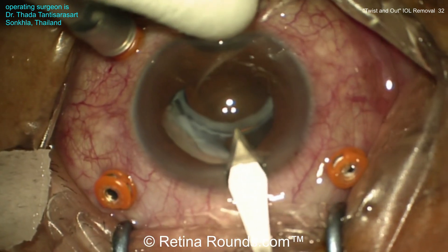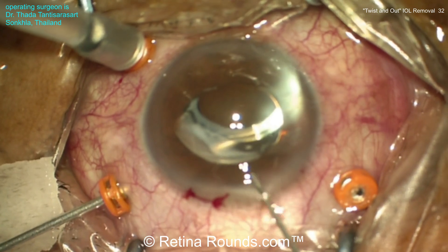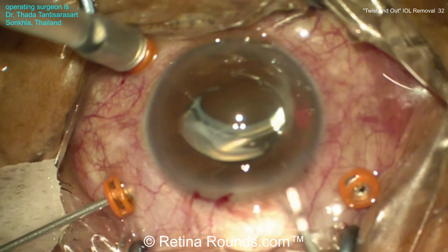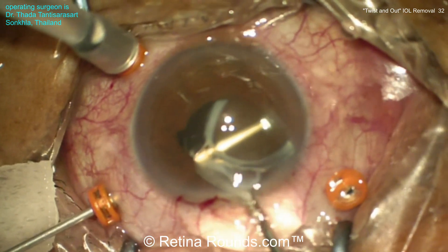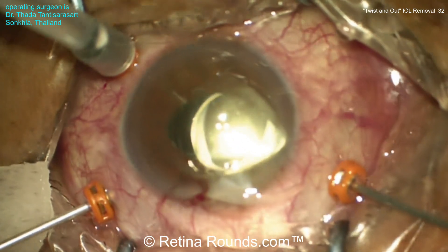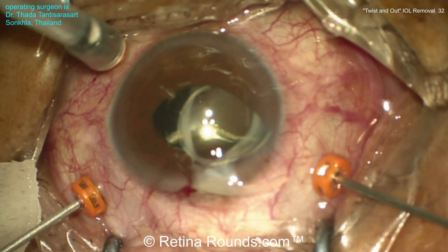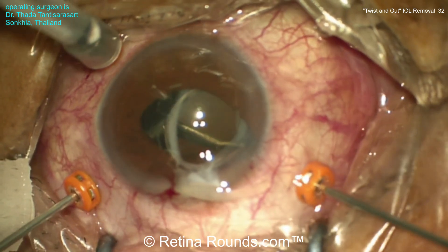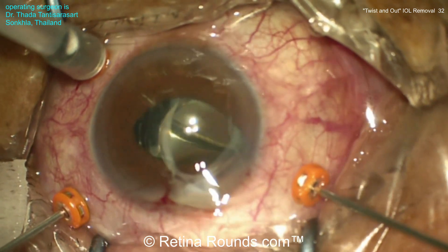The surgeon is starting by creating a clear corneal incision, and you can see that wound is being enlarged. Using a forceps, the dislocated intraocular lens haptic is being externalized through that clear corneal wound to hold the lens in place. This looks like a 23-gauge vitrectomy, and so an anterior vitrectomy is being performed here, intended to disentangle the vitreous from the lens itself before it's externalized and removed.